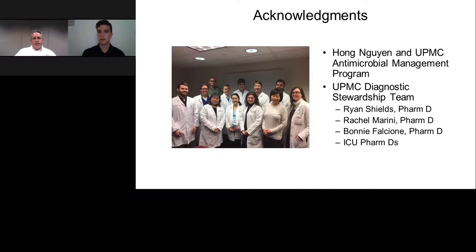Right. I alluded to this a bit, Xavier. What I don't think is going to work is rolling it out willy-nilly across a hospital or across a healthcare system. I think time spent up front trying to consider the patient populations who are developing these types of infections, and what the antimicrobial usage and resistance in those particular populations is, will be time well spent, because you'll get your biggest bang for the test by using it judiciously in those patient populations.